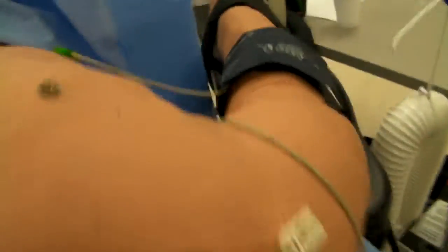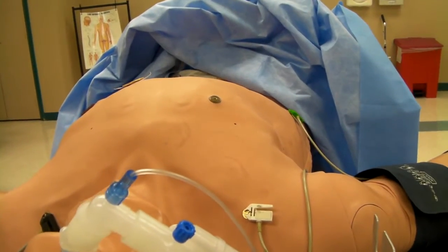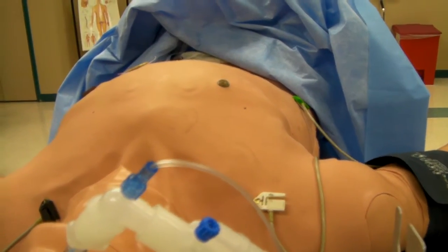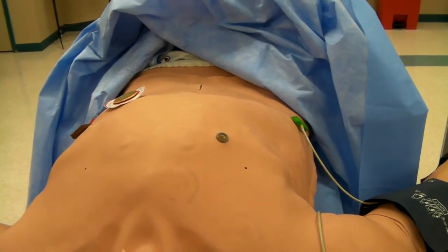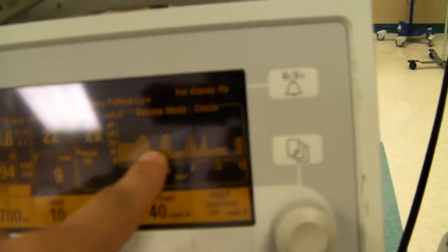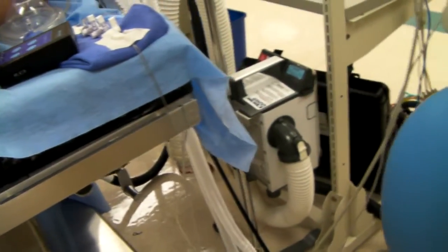So here are his EKG leads, but basically watch his chest as I squeeze this. Squeezing. I don't know if you could see it, but it follows that, and you also get the amount of CO2 he's breathing out over there. I've learned a lot just doing the simulation by myself, so I'm getting more prepared.